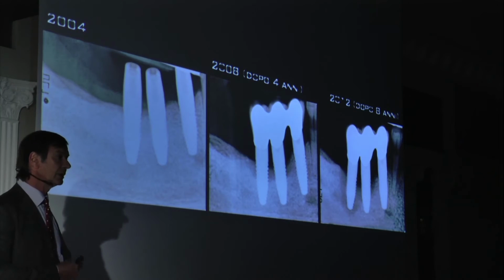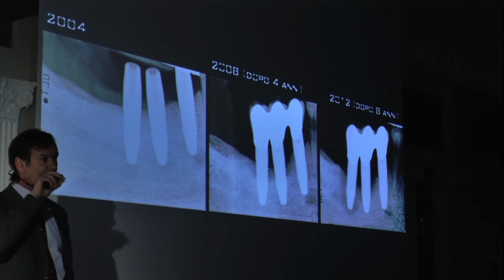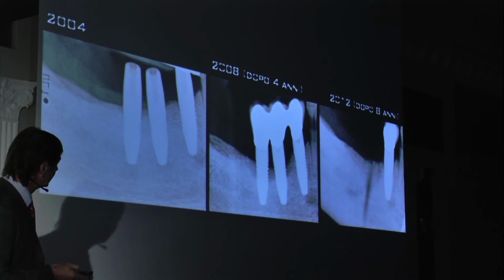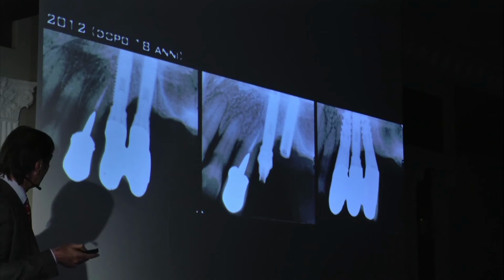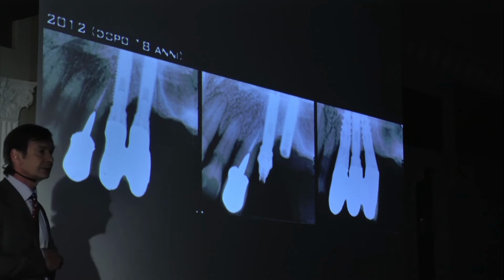and I was not able to do anything for these implants. Because once the bacteria are on the surface, there is no way to get rid of them. So if you look at, this is the final story. I had to remove 2 implants. And if you look at after 18 years, I had the problem also in the machine surface implants.